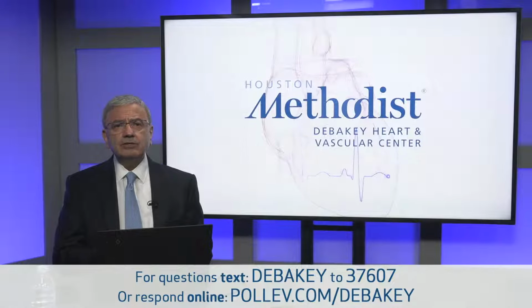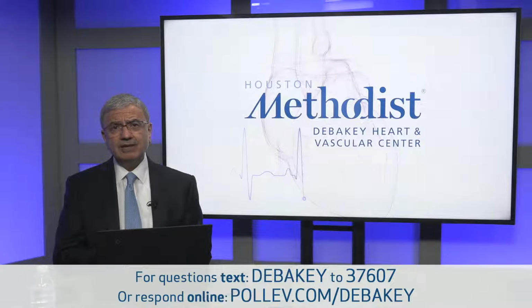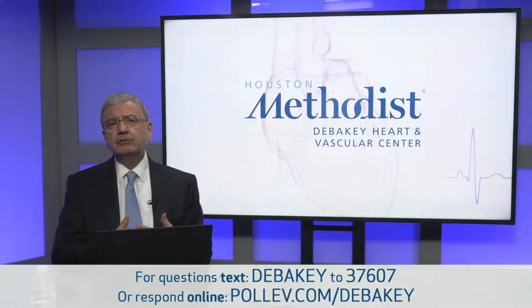What are the advantages of contrast-enhanced ultrasound? You could see some of the advantages that we talked about. To me, the most important advantage is to render a very difficult study into a more interpretable and more accurate study. Remember one thing though, use it towards the end of your usual imaging with echocardiography. Why? Because it will take some time to get rid of the contrast.